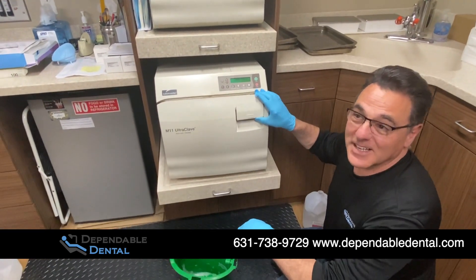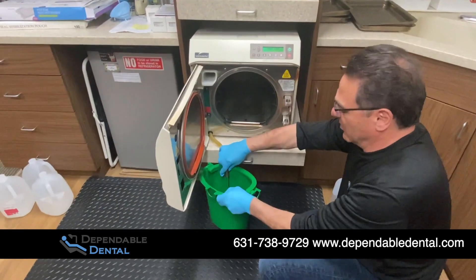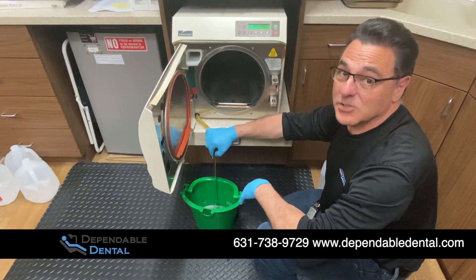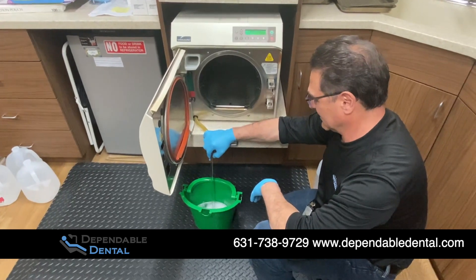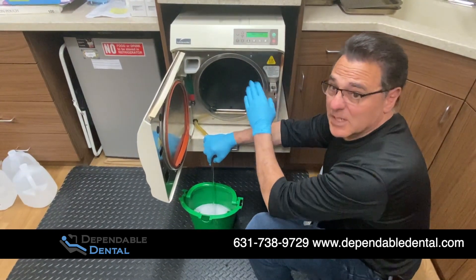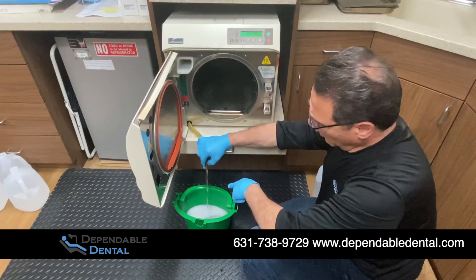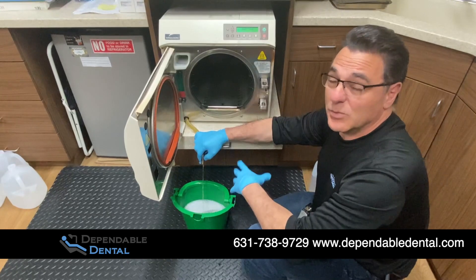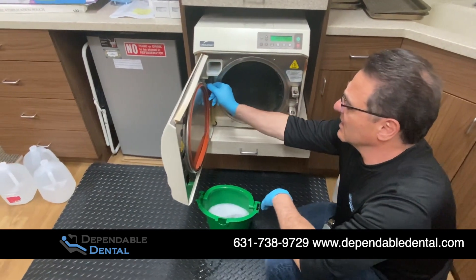We've completed our venting cycle. We're going to open up the door and stop the cycle, then drain our reservoir to get any of the residual dirt and cleaning solution out. Now is a good time to wipe it down with a damp cloth inside the chamber. We also like to take this used cleaning solution and dip the trays in it. If you have a weekend, you could dip the tray in it — it'll come out surprisingly clean by just letting it soak.